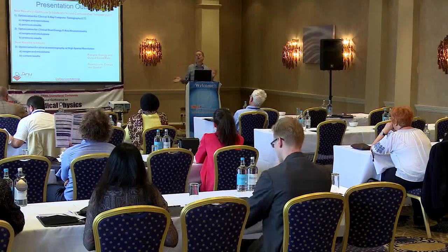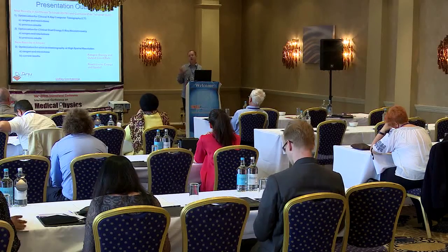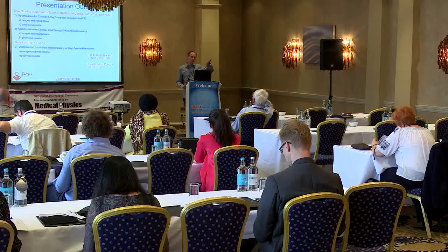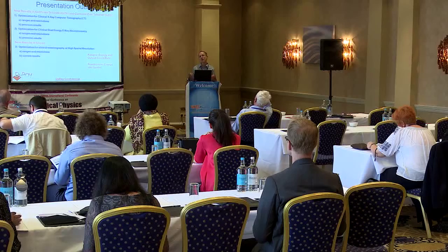And for ranges, I want to define two types of ranges. One is the energy range, often called the dynamic range, and another range is the output count rate range. And for the resolutions, I'd like to talk about the energy resolution and the spatial resolution. In talking about the dynamic range, in conventional radiography, which uses energy integrating detectors, the dynamic range includes both the number of photons and their energy, since this is integrated into the detector. But with single photon counting, these two ranges are separate.